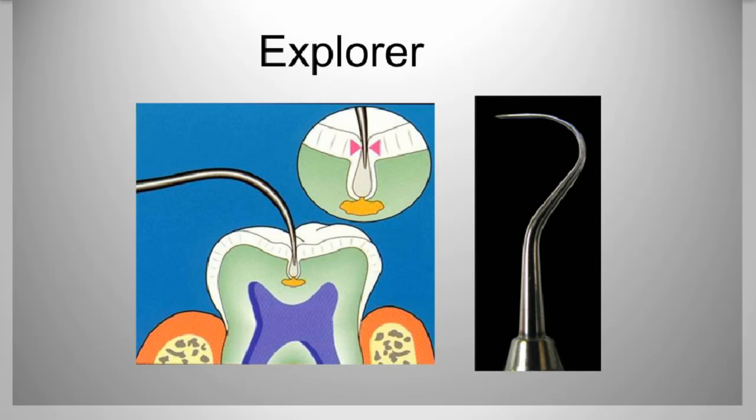So many times, even with the sharpest Explorers, we can't get that stick, which we all know indicates that there is something, either a sealant that needs to be done or decay. So again, we find ourselves in a different place than we were years ago, back 30 years ago, just reflecting on my own experience. So we need a little bit more than just a sharp Explorer.